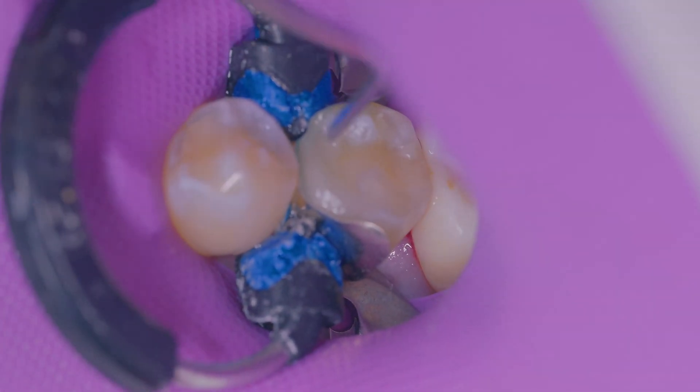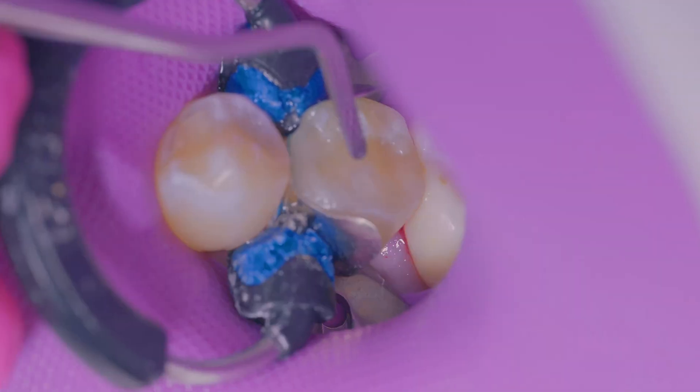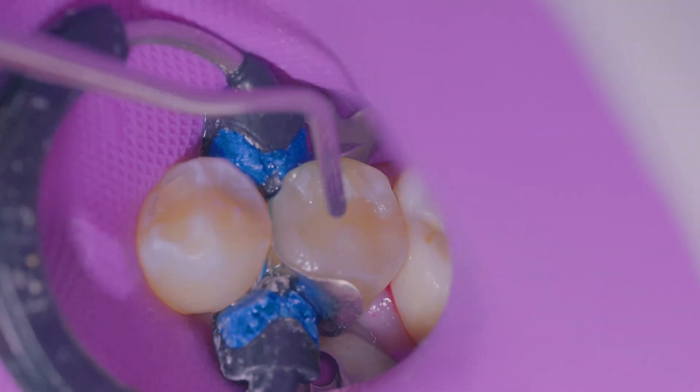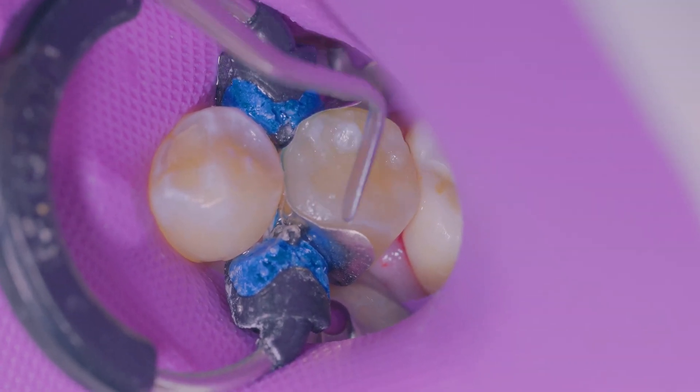You'll also notice the wonderful chameleon effect this material has to the adjacent tooth structure. Kerr's Simply Shade bulk fill material only comes in one shade and it does truly match the 16 shades of the classical Vita shade guide.